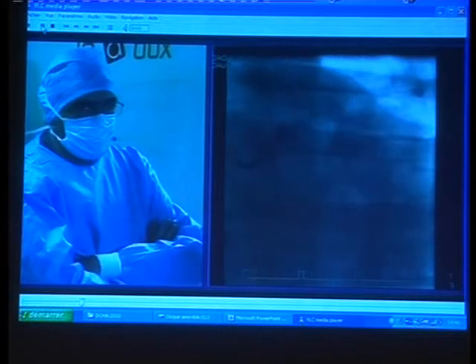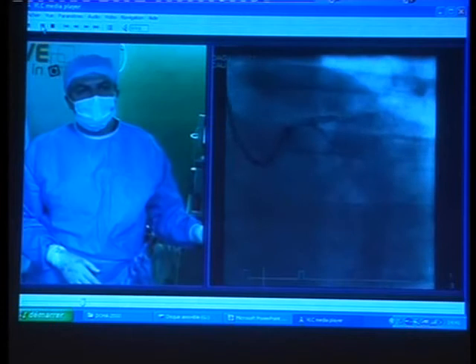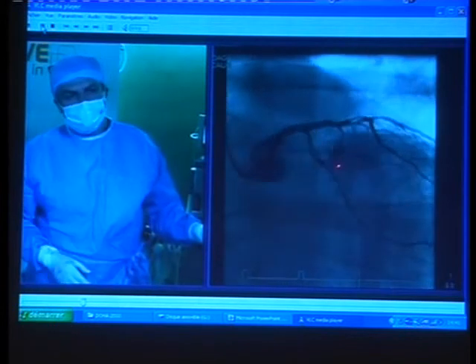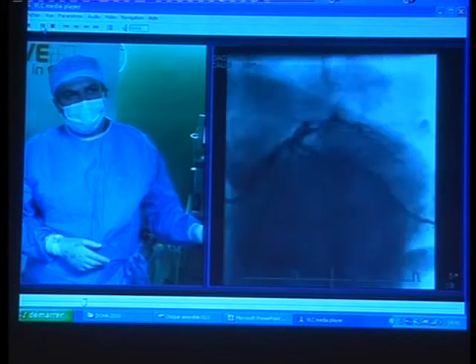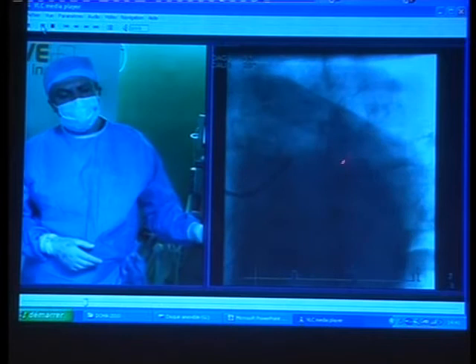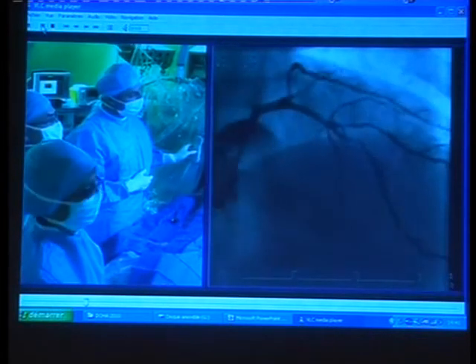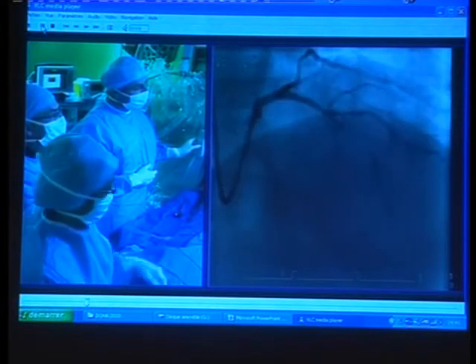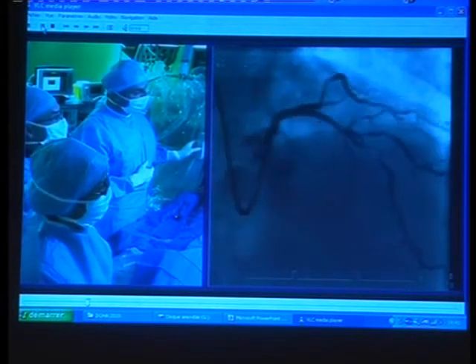Okay, Jean, I will show now the angiography of this patient on the left coronary tree. You can see here the mild stenosis on the first obtuse marginal branch. We see a little bit better on this view. It doesn't seem to be critical. And now we can see better the tight lesion on the mid LAD, with also an involvement of the main diagonal branch.